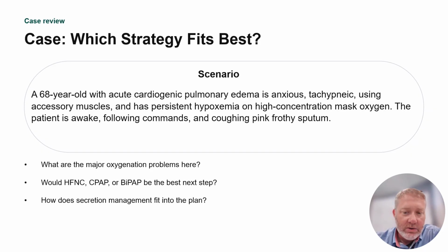What if it doesn't? We don't have a blood gas to be able to compare anything. So you would still likely want to get a blood gas, and then you can determine what to do based on that blood gas. If the blood gas comes back and they have a ventilation issue along with it, so low pH, high CO2, then you might need to switch to BiPAP, because BiPAP helps with ventilation, whereas CPAP only helps with oxygenation and pushing off fluid from the lungs.